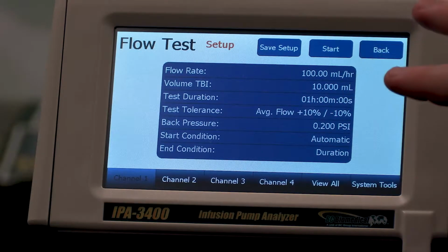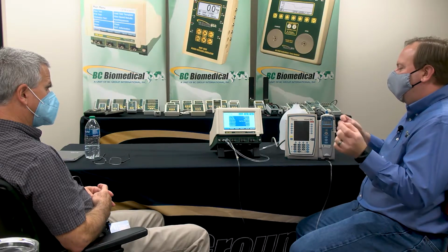Everything in here is based on pressure, not bubbles. A lot of the other ones, we've talked about bubble detection or edge detection. Sometimes they inject a bubble and they track the bubble down a line of LEDs. We're not doing that. We're measuring the pressure, and when the pressure gets above this back pressure setting, that's when we start moving and we control to that pressure.